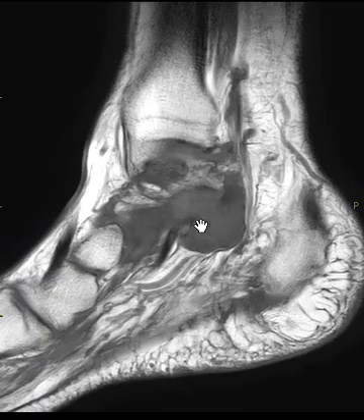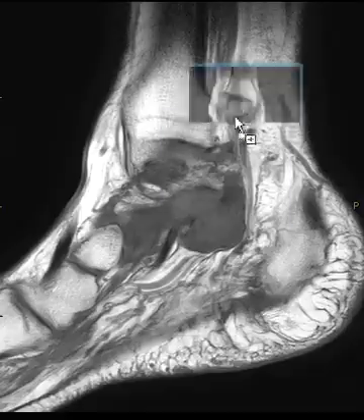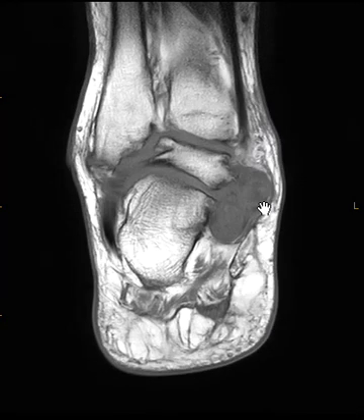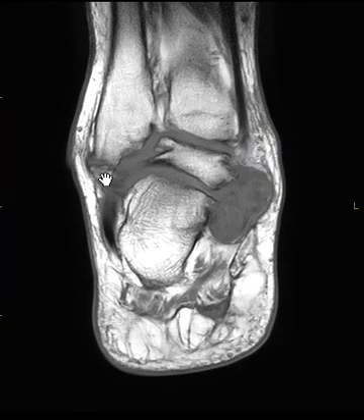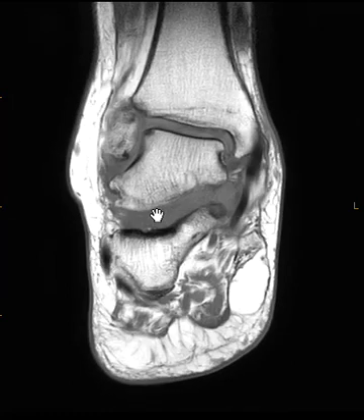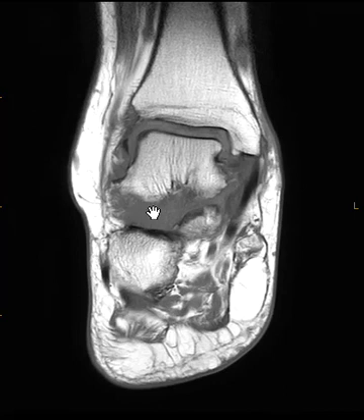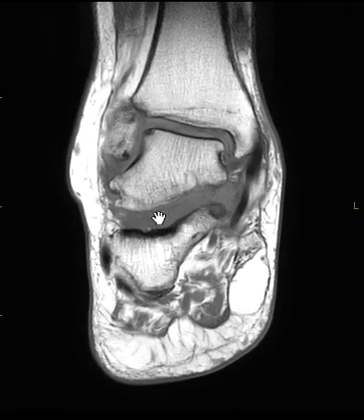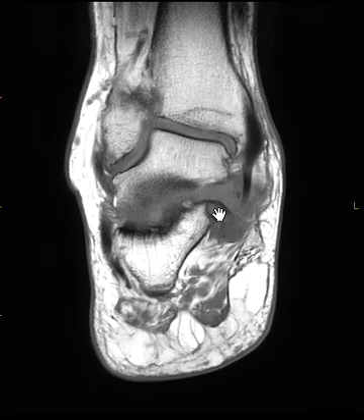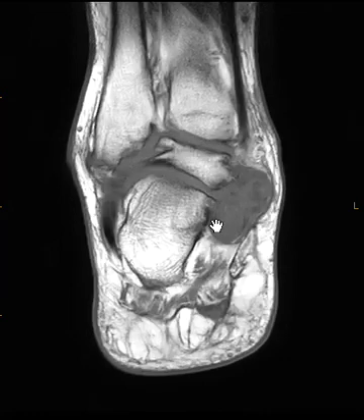Now we're going to look at a coronal T1-weighted image. This one is very nice — we can see a couple of things incidentally. It looks like they have an old ununited fracture here at the fibula. Here's the tibia, here's the sinus tarsi filled in with this process, and we can see the continuity coming over here medially, with bone erosion of the calcaneus adjacent to the middle subtalar joint, and then this big tumor-like process here.